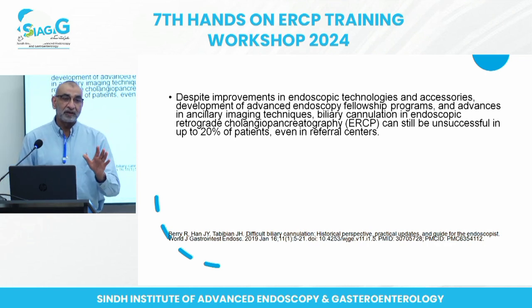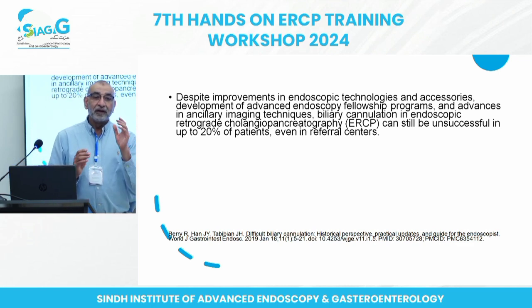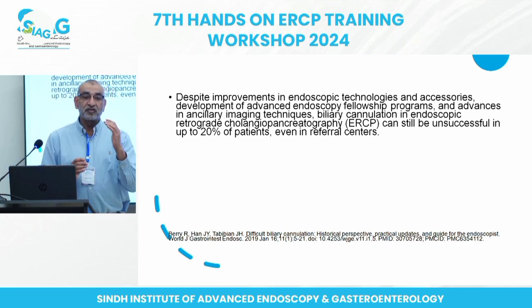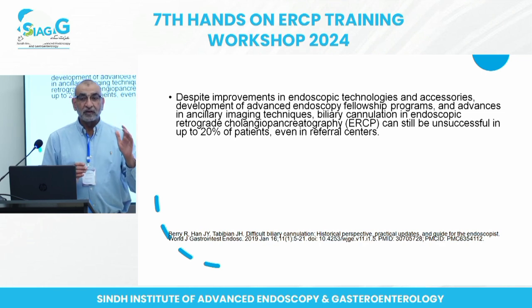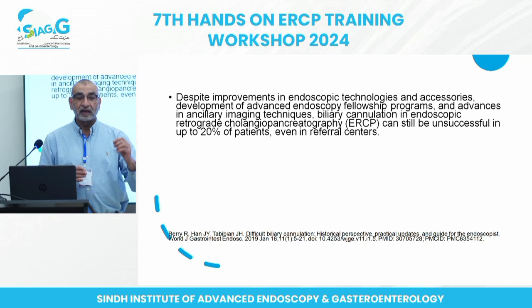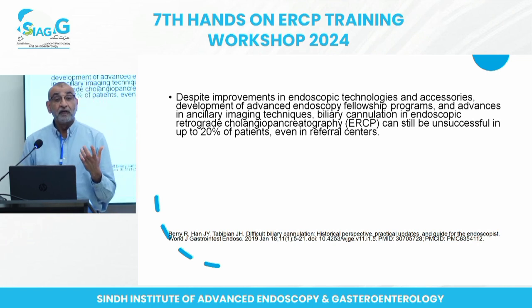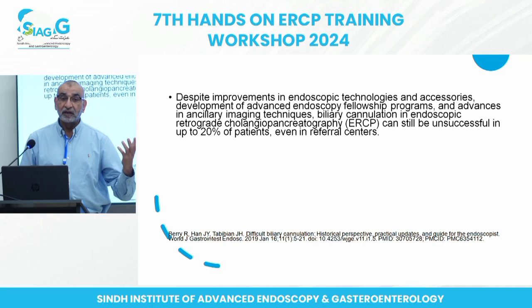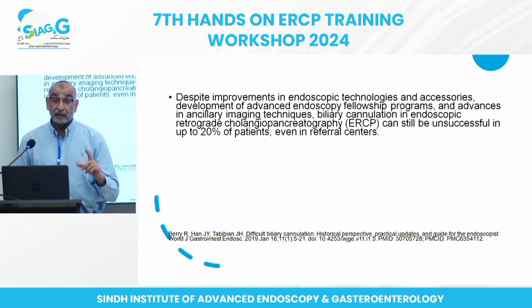It just stresses how important the limitations or challenges in ERCP are. Despite all the innovation and improvement in techniques and the accessories and everything, there is still an expected failure rate of up to 20% in ERCP cannulation, which is very high.